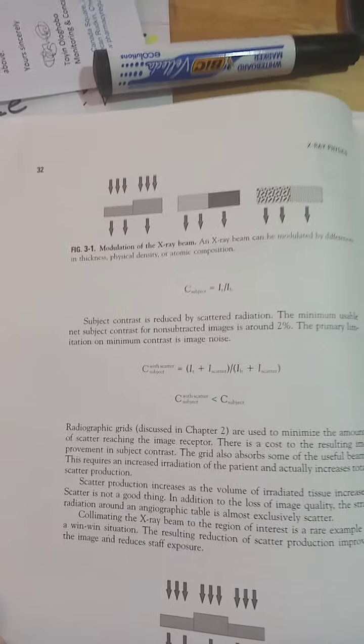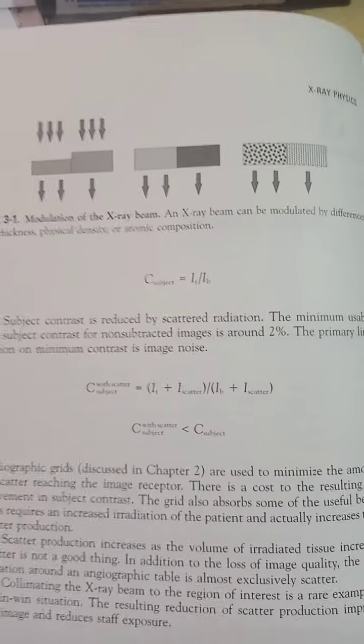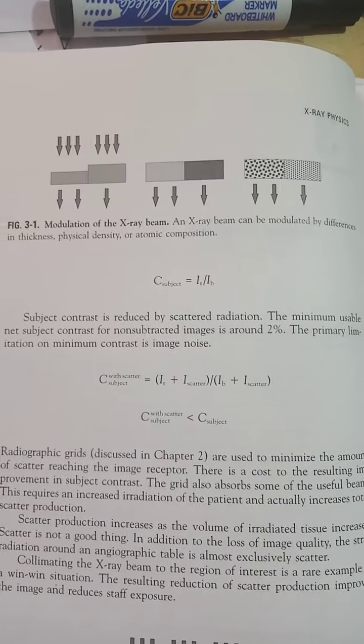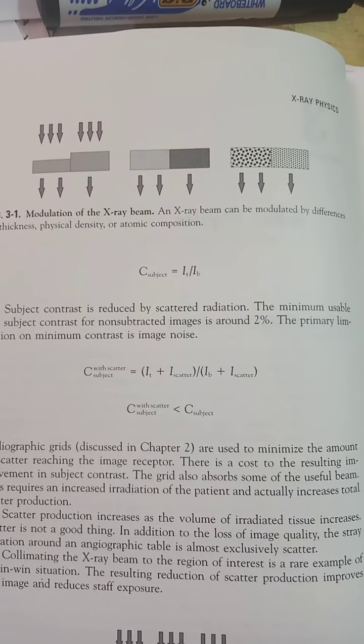In mathematical terms, it's like this. This is the X-ray beam modulation for the differences in thickness, physical density, and atomic composition.